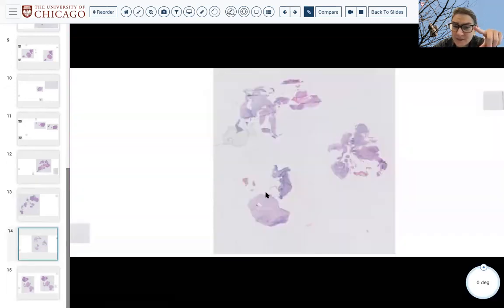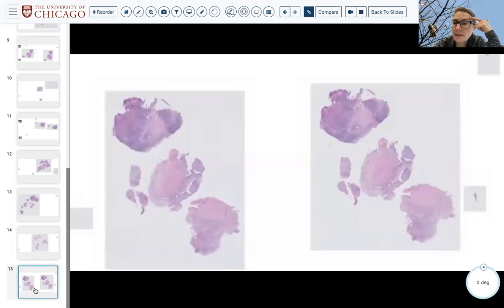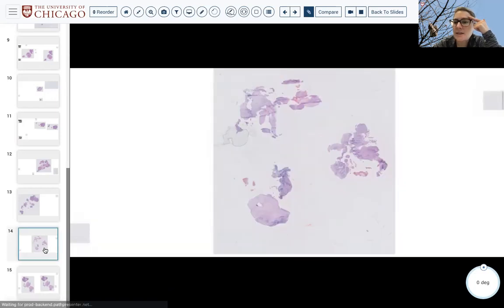So the second point of this case is, yes, they do taste good, those potatoes. The second point is, if you ever have a piece of tissue like this unfrozen and you don't see cancer, think about what could be remaining in the chuck, right? And get deepers. Please don't ever be afraid to get deepers when you're not seeing what you think you should see. And that's my last point.